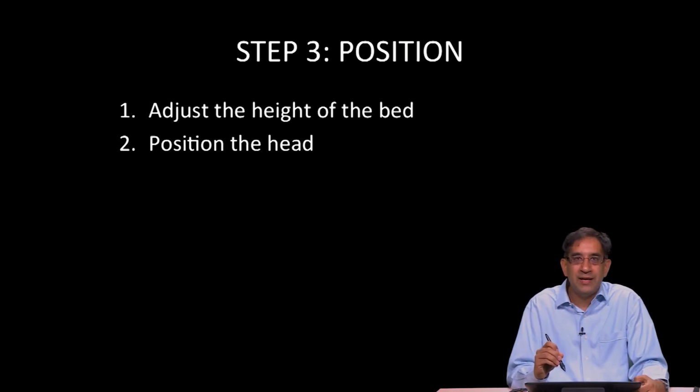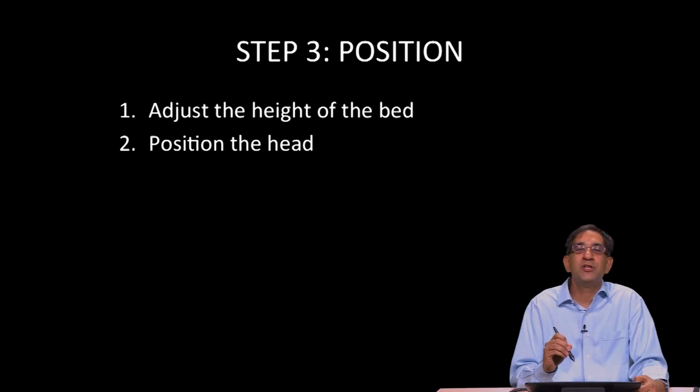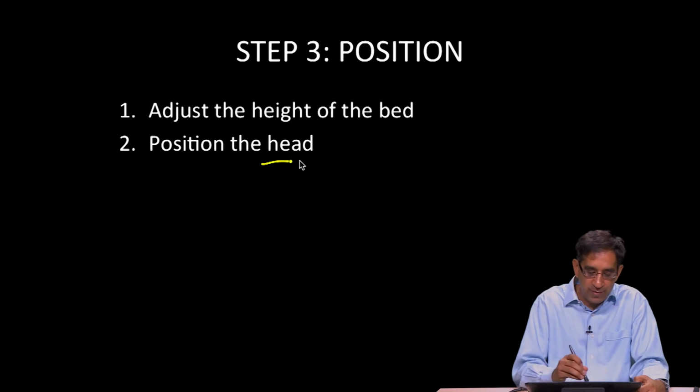Step number 3 is also an important one. You're going to adjust the height of the bed for yourself. Whether you're short or tall, you want to get the height of the bed to a position where you're not going to be straining your back to perform the procedure. And then you're going to position the patient's head.